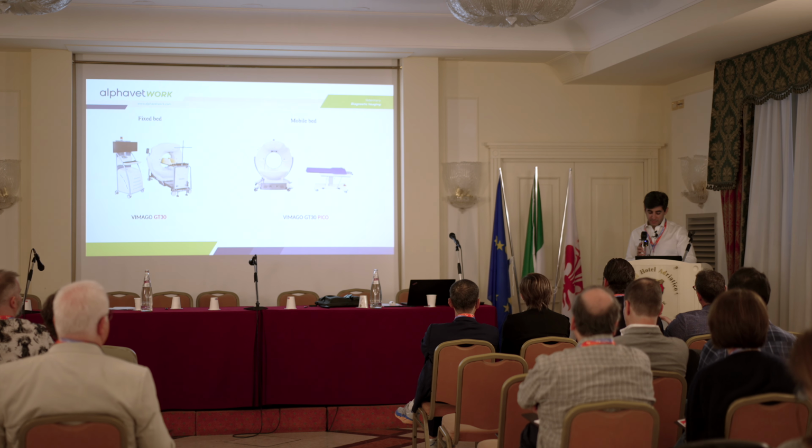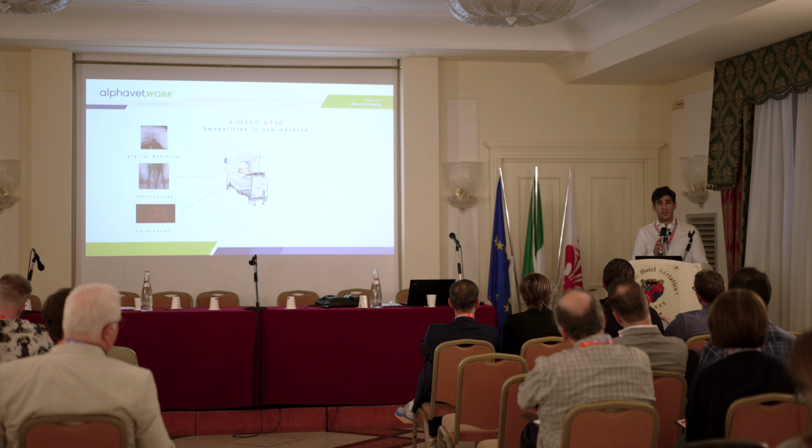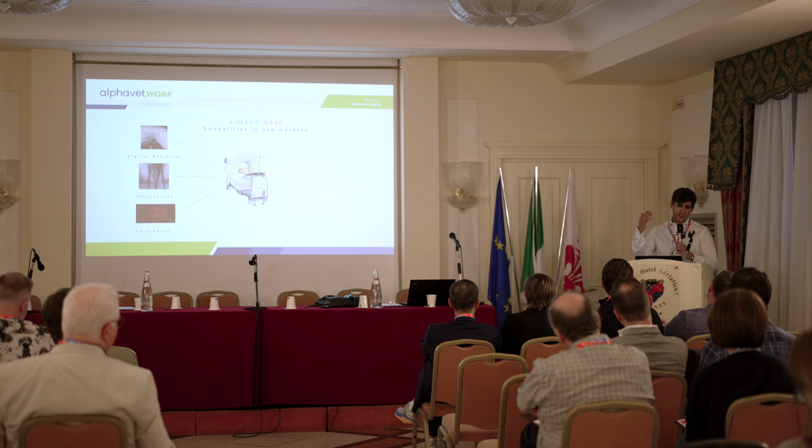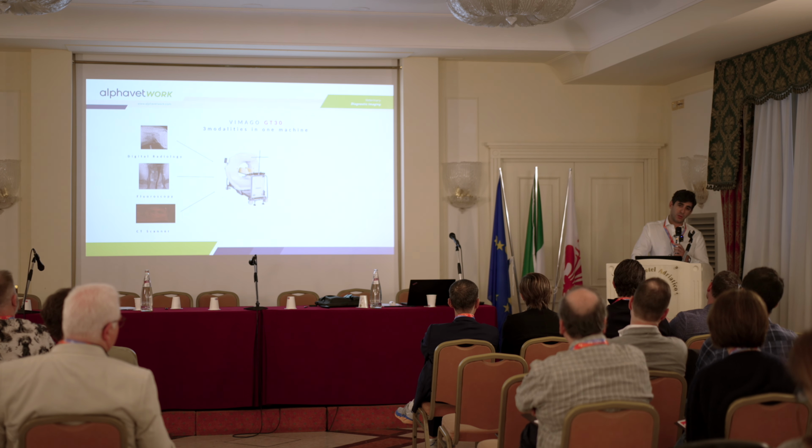when you compare something, you have to compare similar things. So when a vet is going to buy a CT, it's going to be an entry-level CT of 16 slices that they call 32, with all the software applications. What does it mean? That you have a small detector, a slow machine, a small tube, and so you have a lot of limitations in your daily practice.